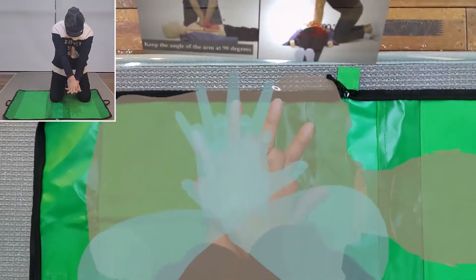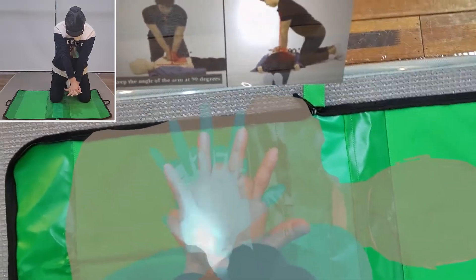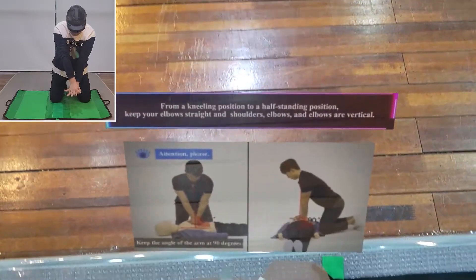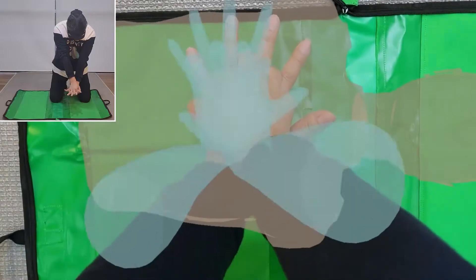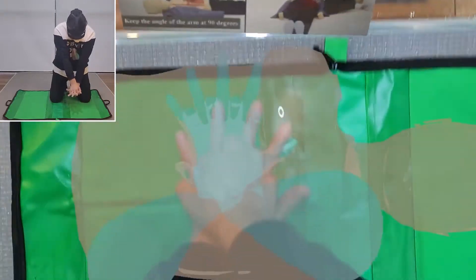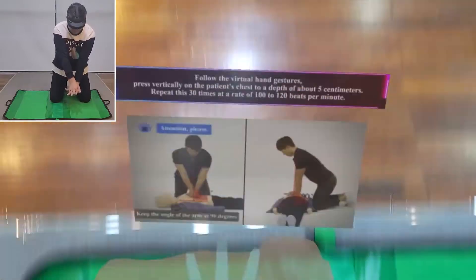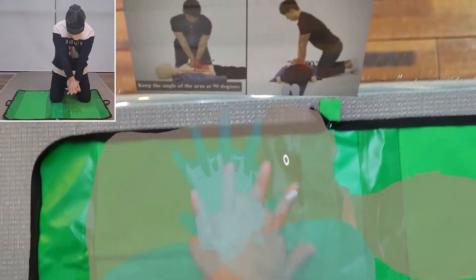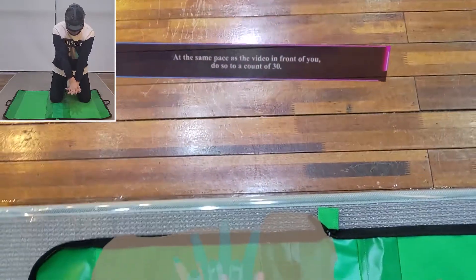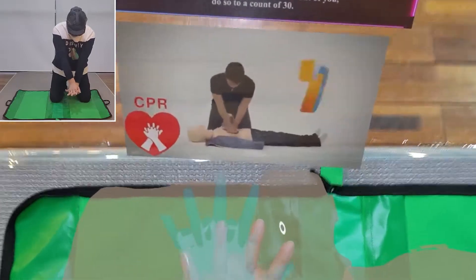From a kneeling position to a half-standing position, keep your elbows straight and shoulders, elbows, and wrists vertical. Follow the virtual hand gestures. Press vertically on the patient's chest to a depth of about 5 centimeters. Repeat this 30 times at a rate of 100 to 120 beats per minute, at the same pace as the video in front of you.